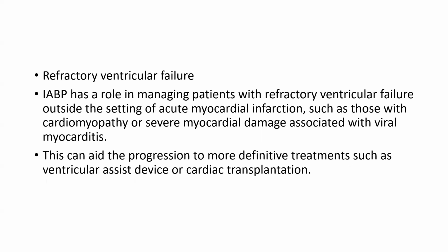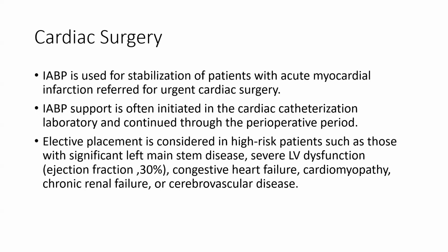Then refractory ventricular failure. IABP also has a role in managing patients with refractory ventricular failure outside the setting of acute myocardial infarction, such as those with cardiomyopathy or severe myocardial damage associated with viral myocarditis. This can aid the progression to more definitive treatment, such as a ventricular assist device or cardiac transplantation.